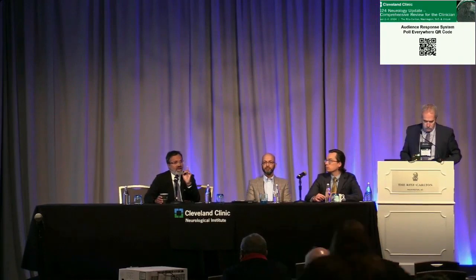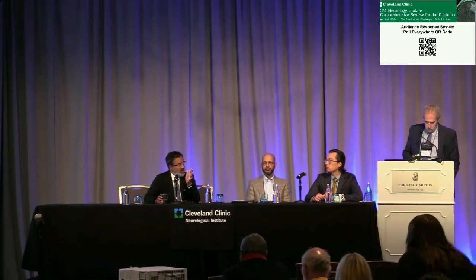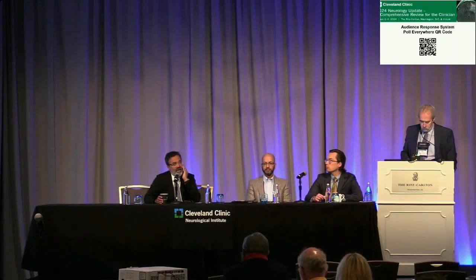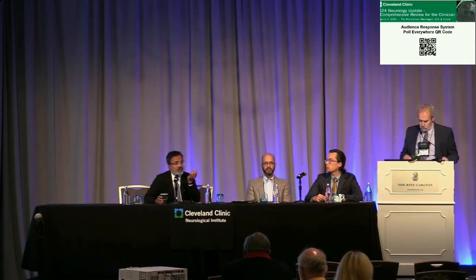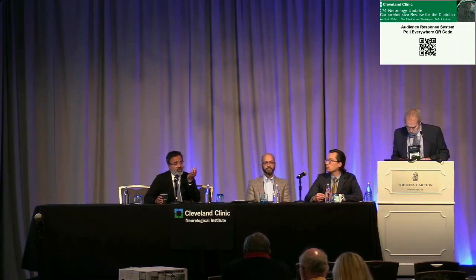Now, in a patient with generalized epilepsy, however, there's a concern about understanding the severity of illness, for instance, absence seizures. Patients are typically great at knowing whether or not they've had a convulsive seizure. Absence seizures are harder for them. And in that situation, when I do see bursts of EEG that are lasting significant periods of time, 10 seconds or longer, then I'm restricting the driving in those patients.